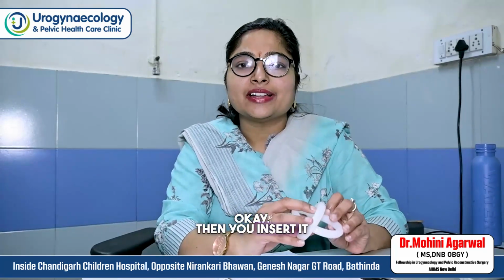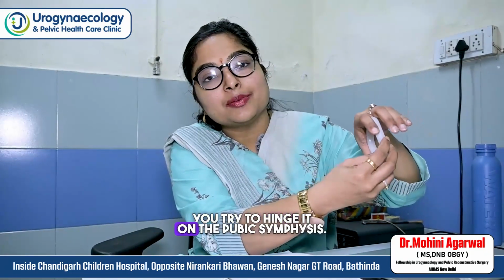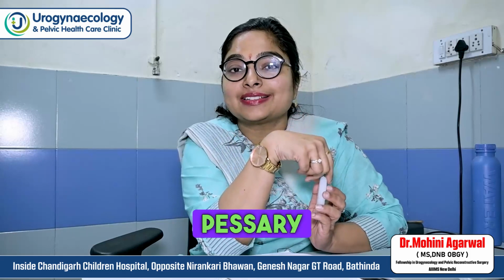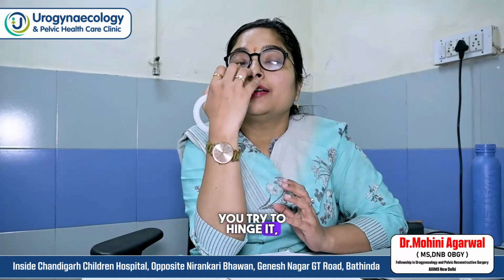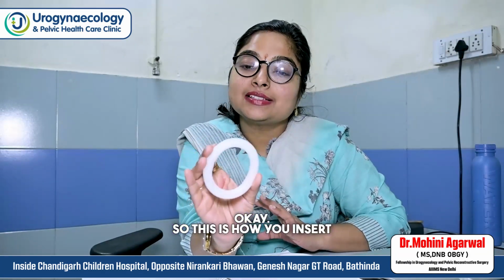Then you insert it as high as possible, and basically what you try to do is hinge it on the pubic symphysis. The pubic symphysis is going to give the support for the pessary. So you try to insert the pessary as high as possible in the posterior fornix, and anteriorly you hinge it, putting the pessary behind the pubic symphysis, because that is going to give the support. I'm talking about the ring pessary. Okay, so this is how you insert a pessary.